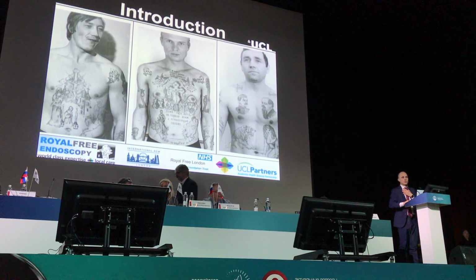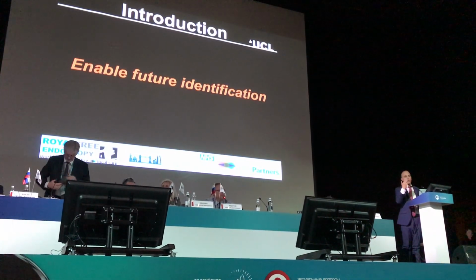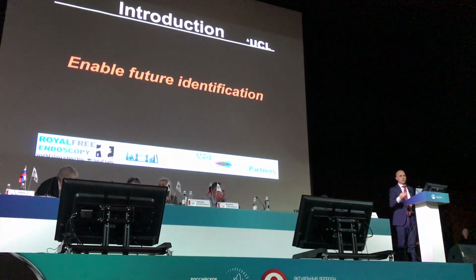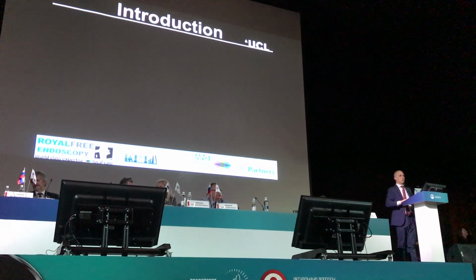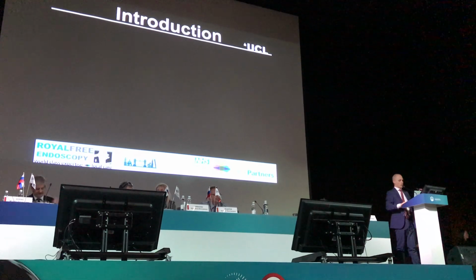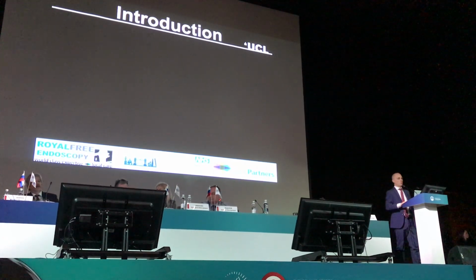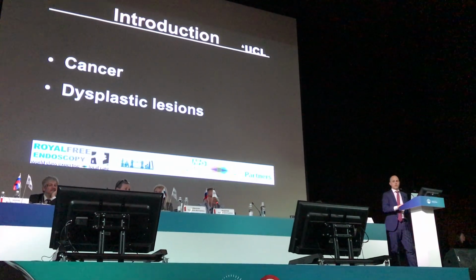In our world, in the endoscopy world, tattoo is important to identify future lesion for future resection or future surveillance. Now, tattoo should be used in the colon and in the small bowel. And why? We should use tattoo when we encounter cancer and when we encounter dysplastic lesion.